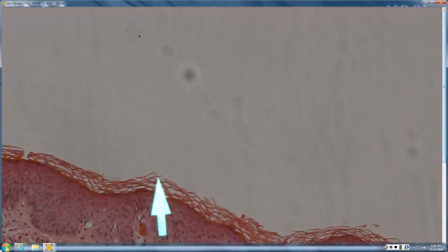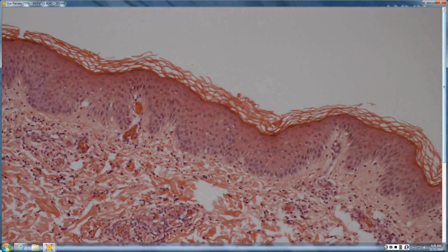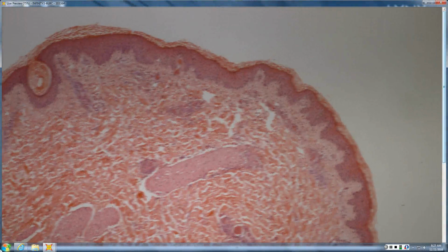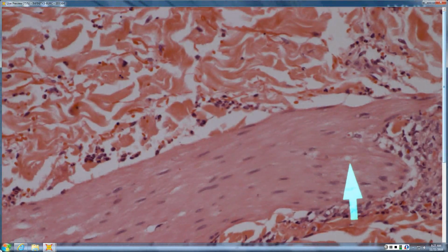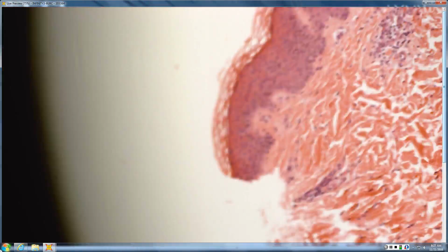Okay. Well, what I saw was the big large nerve in the superficial portion. So I thought it was that. You mean this thing? Probably erector pili. Oh, really? That one is faking you out, looking a little wavy, but you have vacuoles, which are the little glycogen snacks, and big, long, cigar-shaped nuclei. So that's erector pili. Threw me off there.